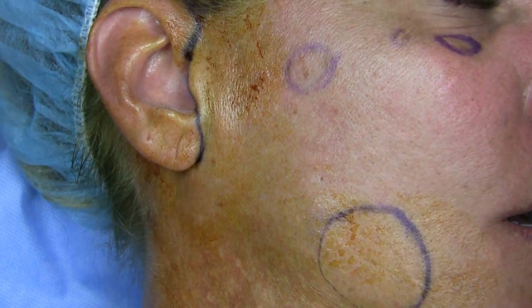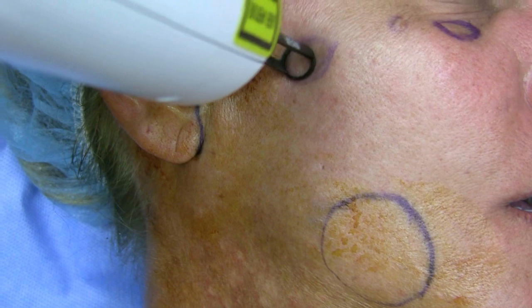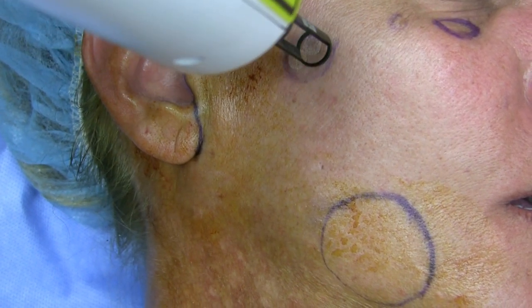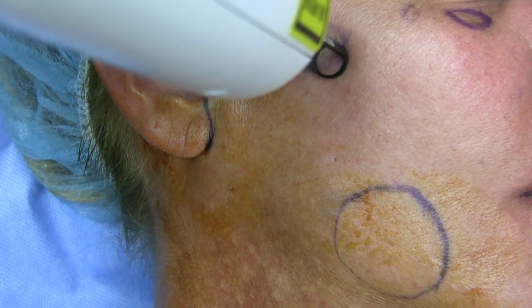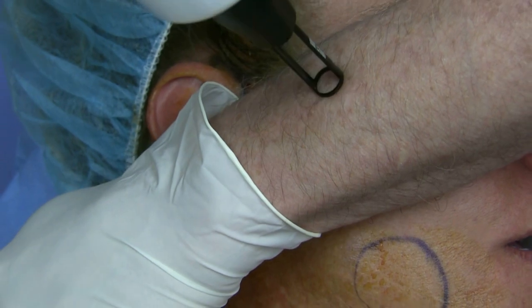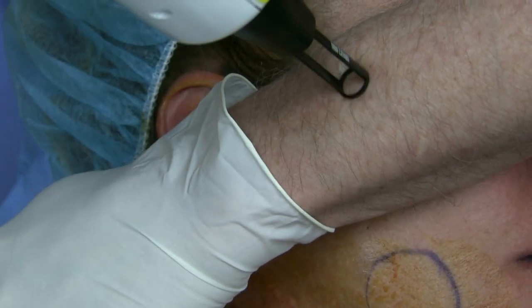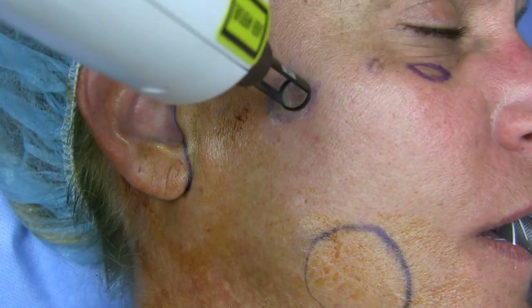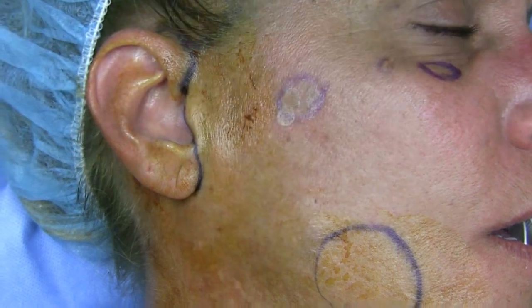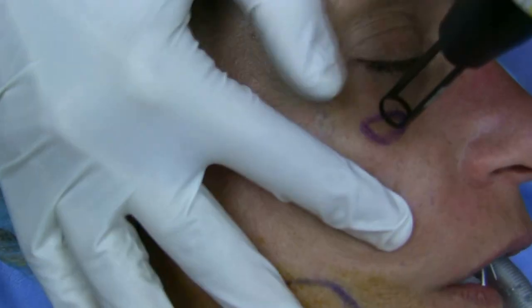This is the erbium and I have this at 800 millijoules. It is a situation where you can do this awake — this is really a painless situation. I'm going to show you on my own hand so there's really no pain with it. And that's what's nice about the erbium laser: you can expeditiously treat brown spots.